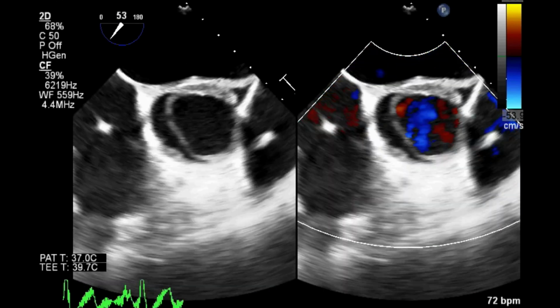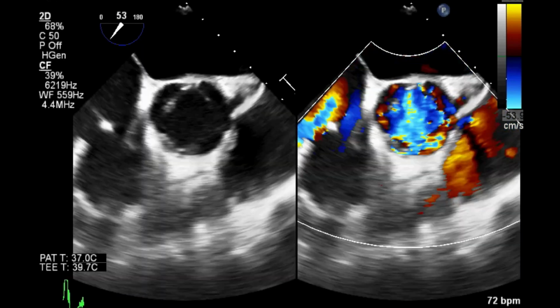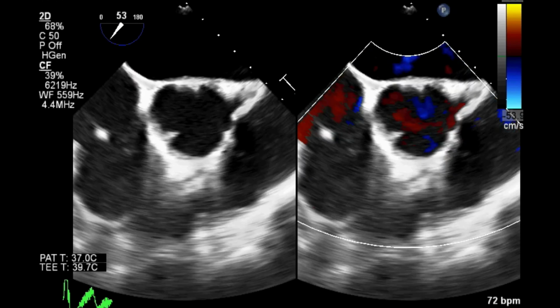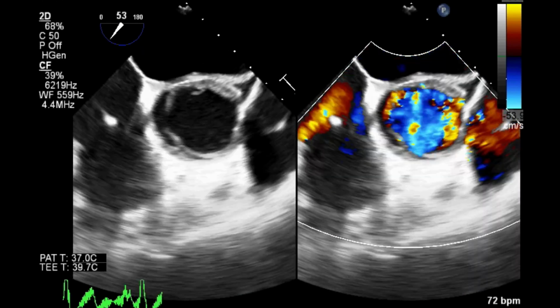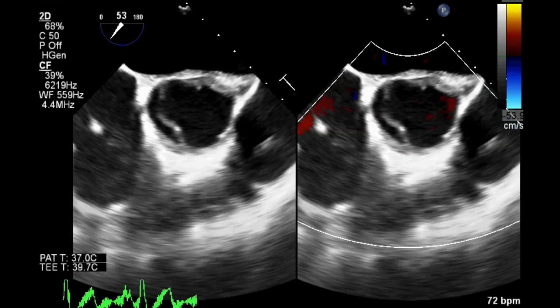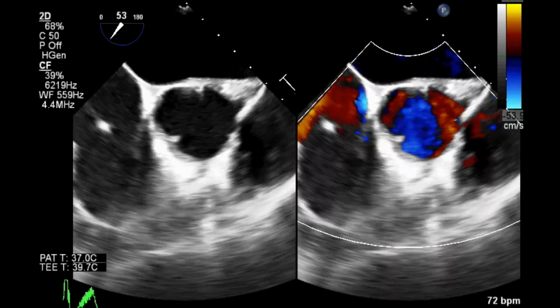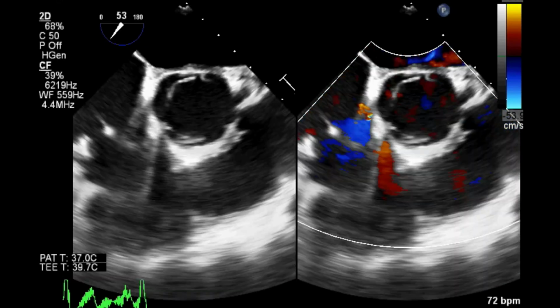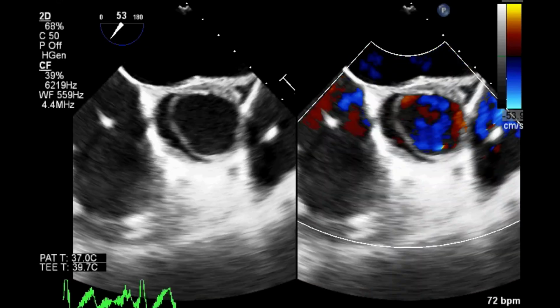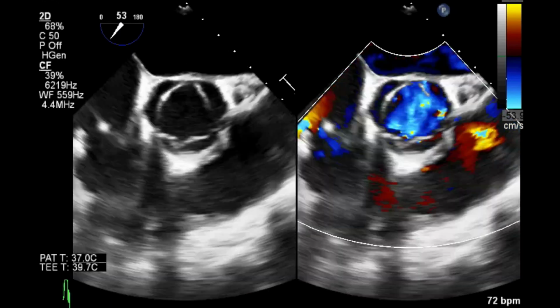Or in those days, when this case was done, we used to give a very high dose of adenosine to stop the heart momentarily, maybe about 30 milligrams of adenosine. We don't do that anymore, but we do rapid pacing. In Germany, they place a big balloon in the SVC and shut down the preload, and the patient's heart essentially stops for a little bit.